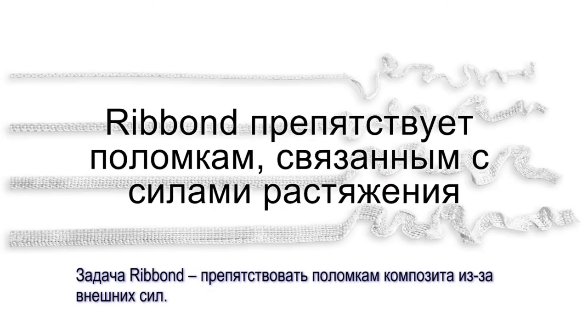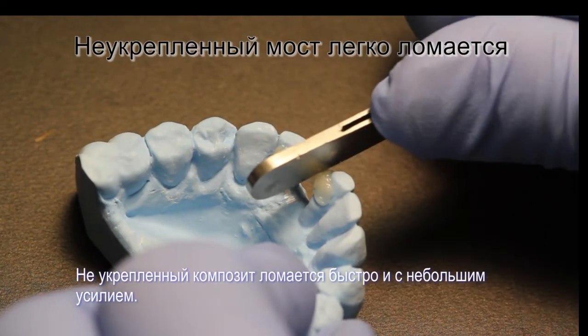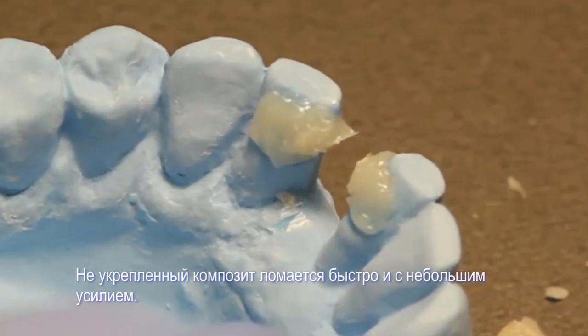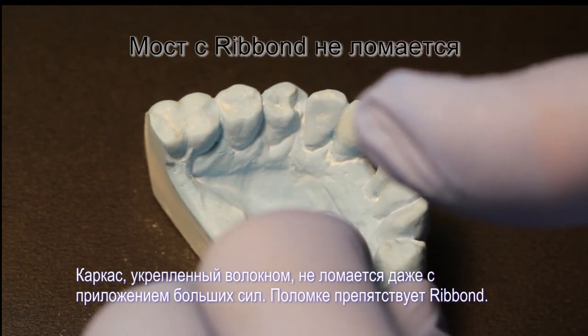The purpose of Ribbon is to prevent fracture failures in the resin caused by tensile forces. Shown here is a model of an unreinforced composite resin bridge framework and a Ribbon reinforced bridge framework. To emphasize the effectiveness of the Ribbon, we made the composite bridge framework significantly thicker than the Ribbon bridge framework. The unreinforced composite broke quickly and without much force. The Ribbon reinforced bridge did not break after significantly more force was applied. As you can see, Ribbon prevents fracture failures.